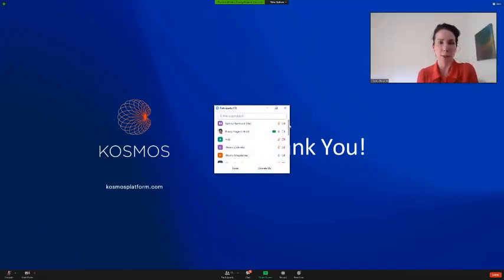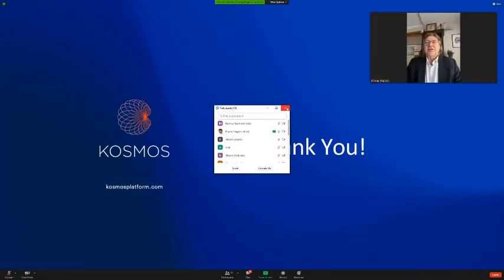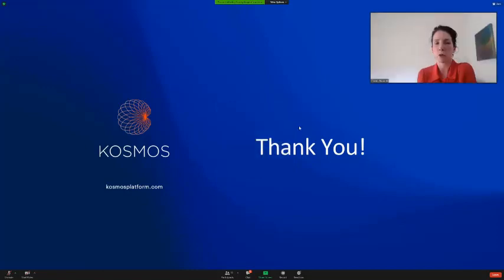So, yeah. So it's coming in August? Yes. End of September or August, yes. So for FAST, you can easily do all the FAST scans, etc. Yeah, no problem. All right.